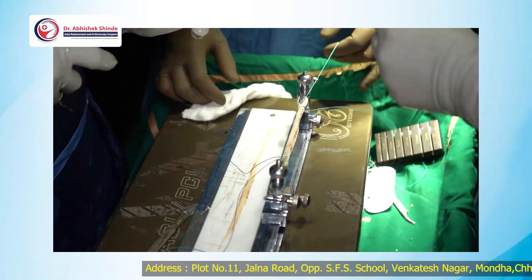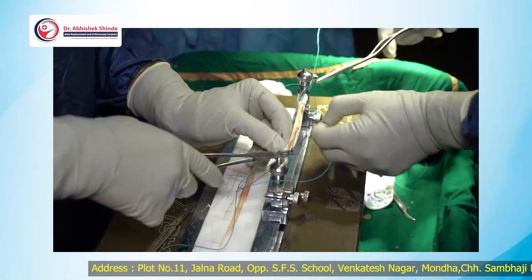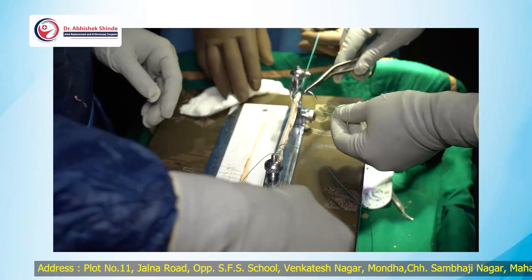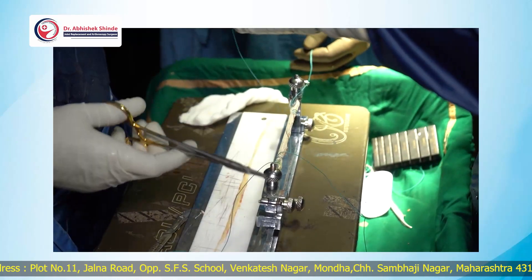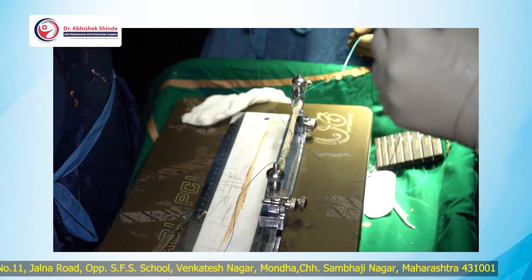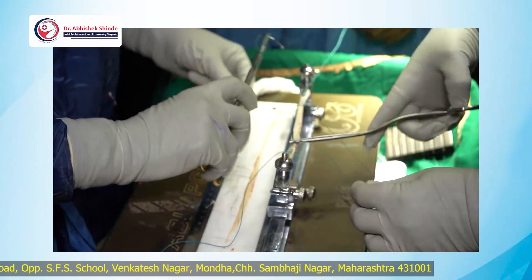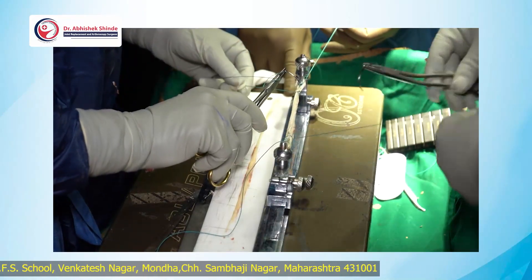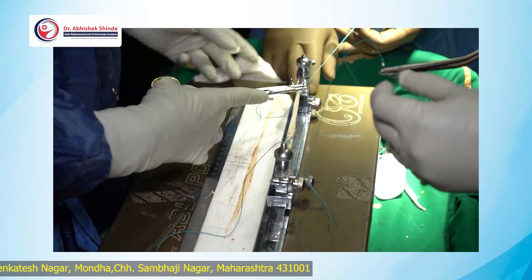You can use a screw as well as a suture disc. This is a demonstration of how to take the stitches — how to take the bite so that the whole tendon is covered. This is the tensioner; you can give tension while suturing the graft.